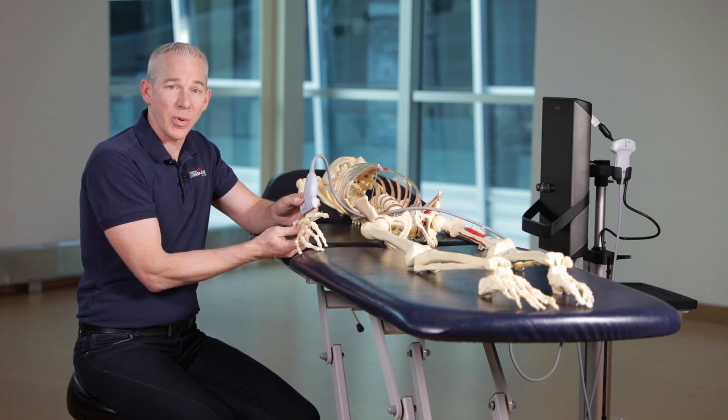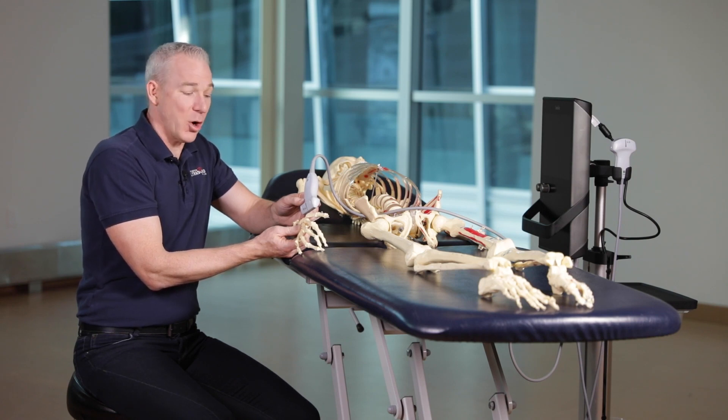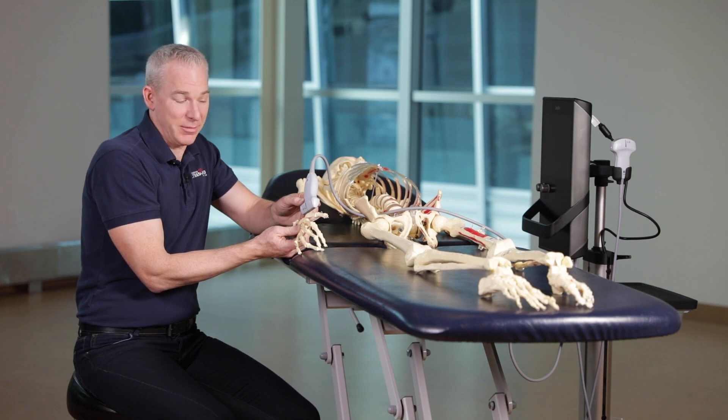The patient position is usually supine with the hand in a position with the thumb pointing at the ceiling. It's neither supinated nor pronated.